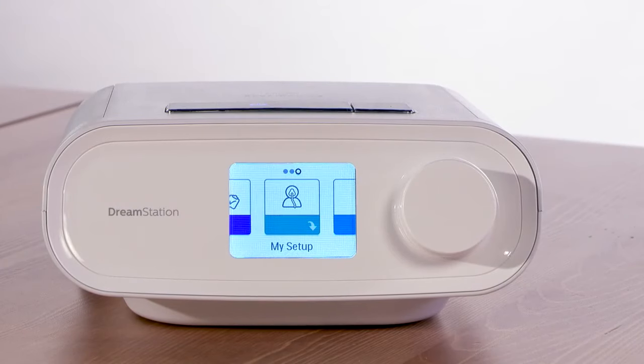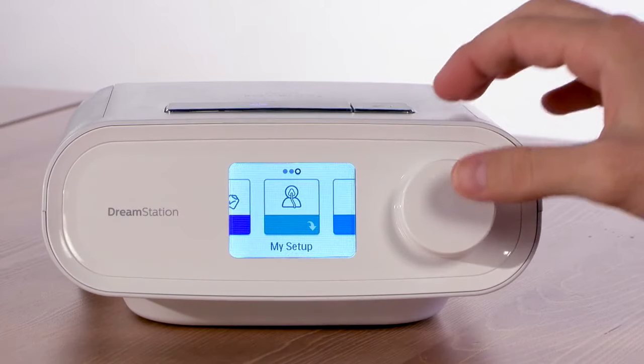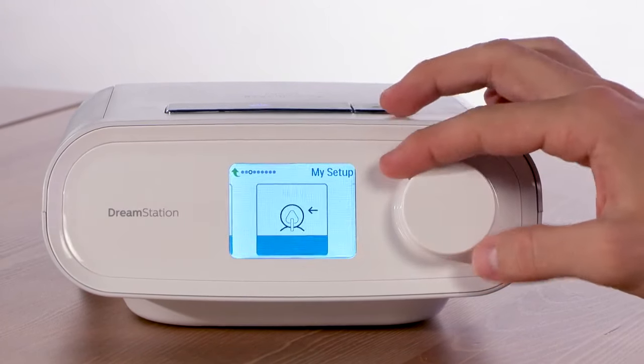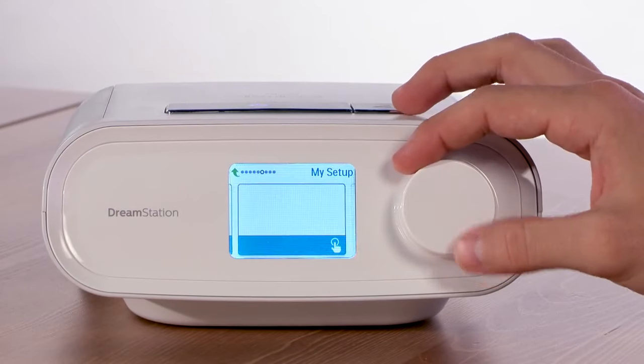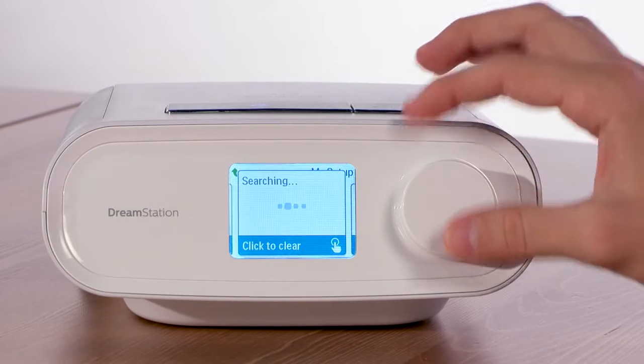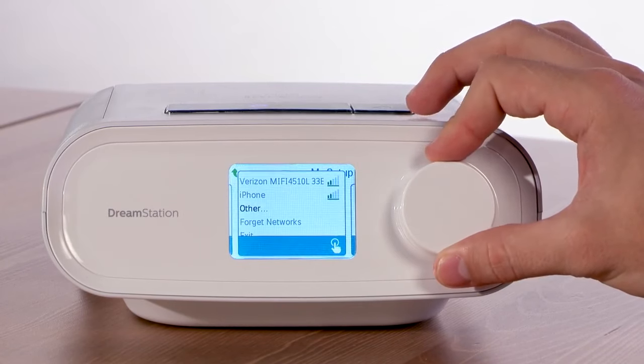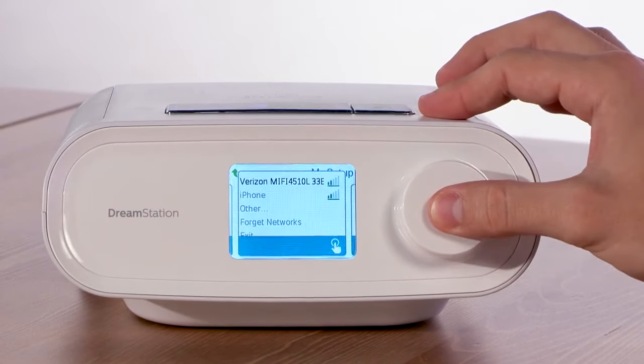Now connect your WiFi accessory modem to your wireless network. First, go to the My Setup menu and press the control dial. Scroll to the WiFi screen and press the control dial to display the available networks. Scroll to highlight the desired network and press the control dial to select it.